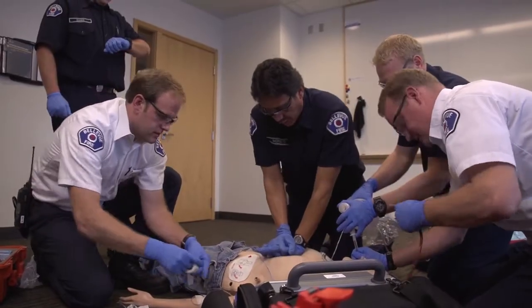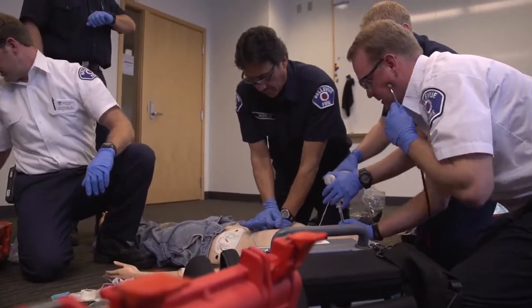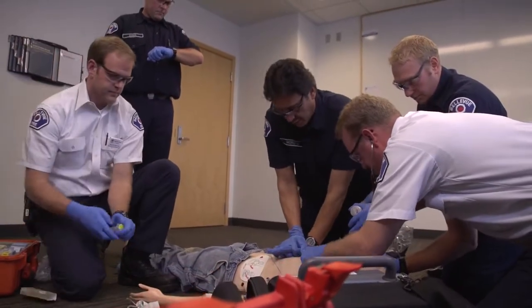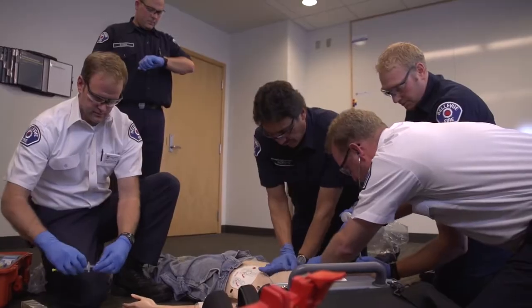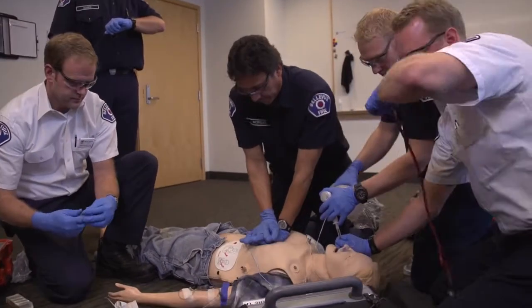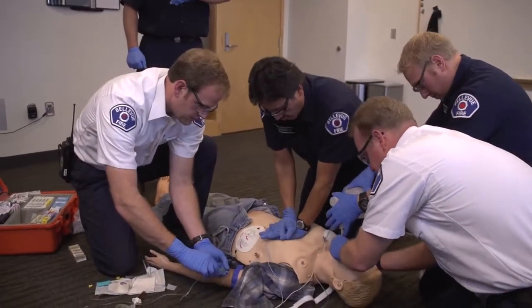Go ahead and continue, just every 10 compressions now. 8, 9, 10. We'll tie our last shock — we'll do the VF. I'm going to go ahead and drop an epi. Another bag. 9, 10. Good lung sounds. Negative epigastric. One minute in.